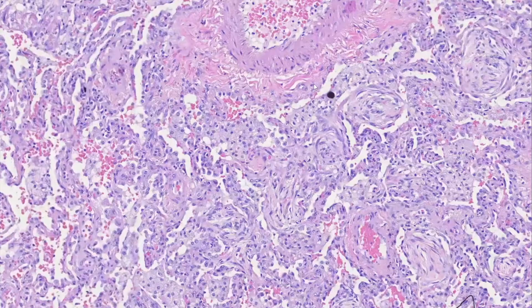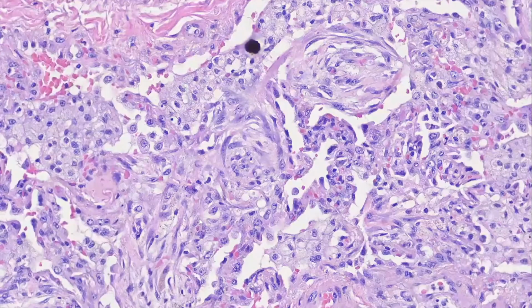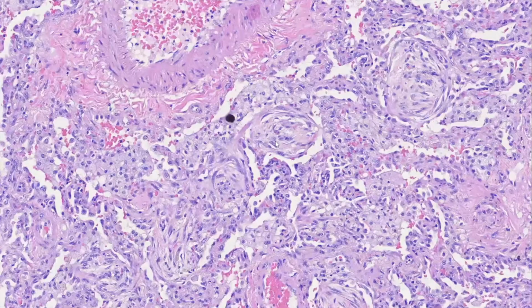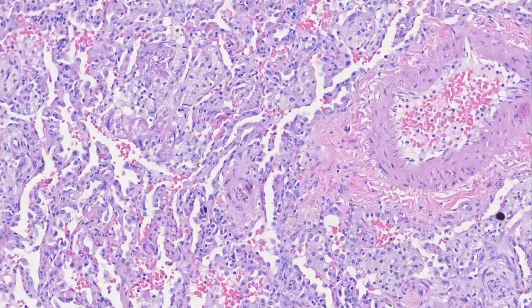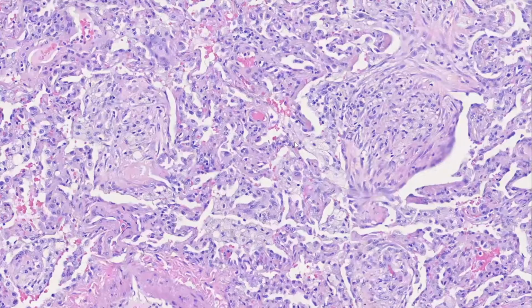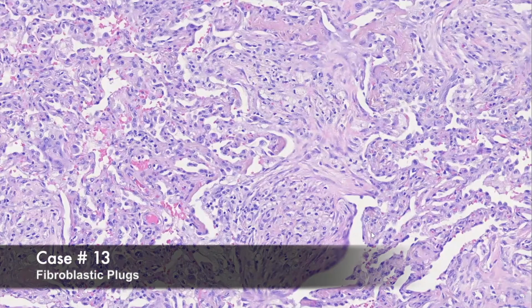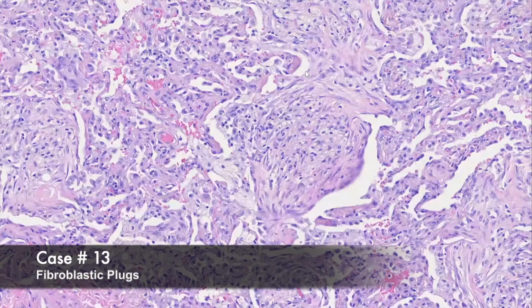And then if we look at a little bit higher power, it appears to be these proliferating fibroblasts. And the fibroblasts have a very loose picture to them, and they almost have this mucopolysaccharide-rich appearance. And they seem to be plugging and filling up these alveolar spaces. And so we call these fibroblastic plugs, and they were previously described as Masson's bodies.